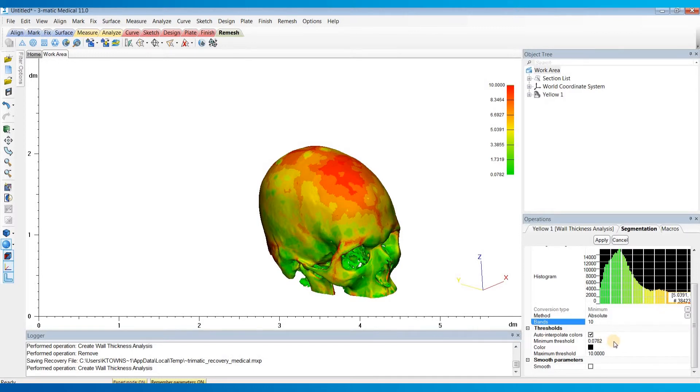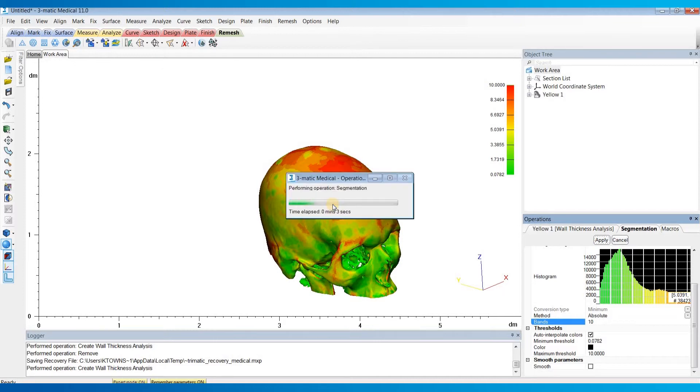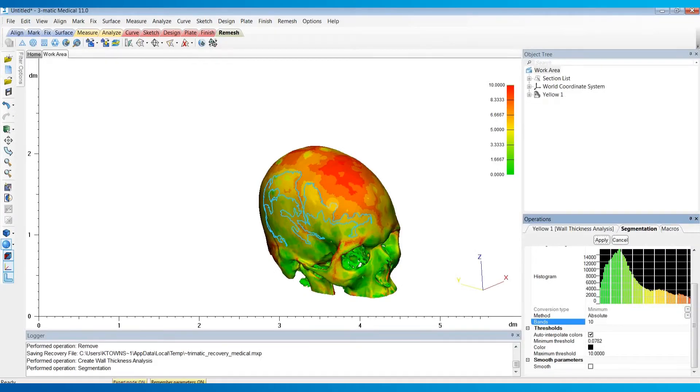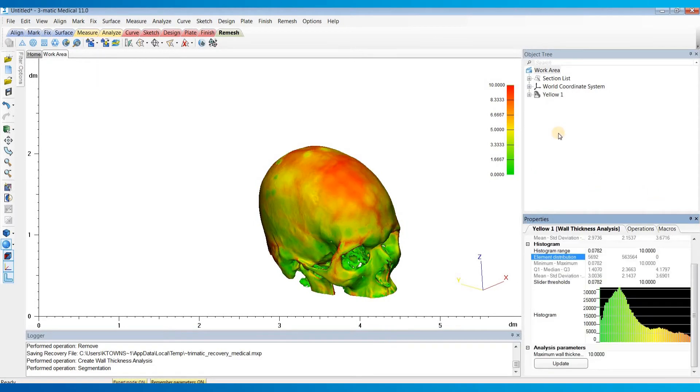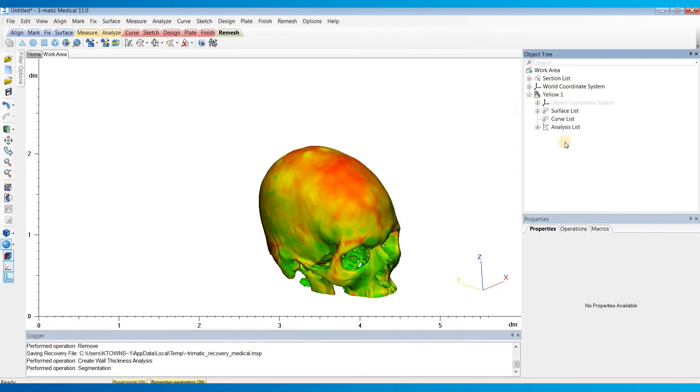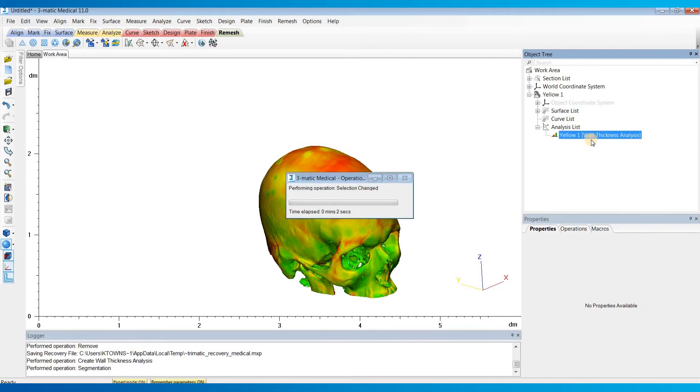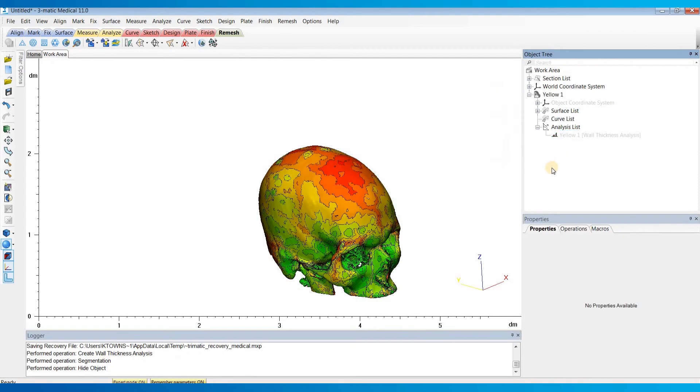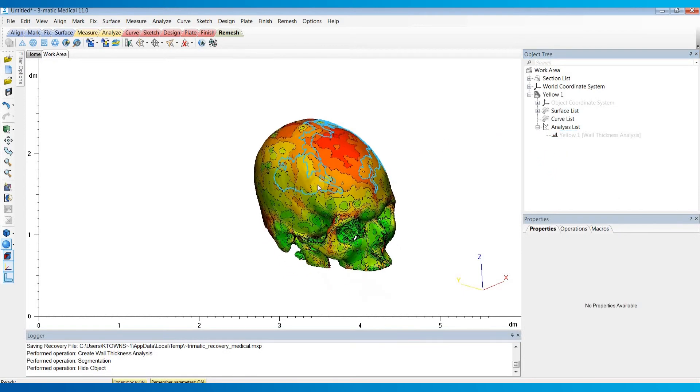So I'm going to go ahead and hit Apply. And so this tool is actually going to separate out our skull into a separate surface for each of these bands that we selected. So once that's done calculating, I'll cancel out of that. And then I'll hit this plus icon to expand our scene tree. And I'm just going to right-click and hide the analysis so we can visualize the surfaces that it split it into. Like so. So you can see there's a separate surface for each of these bands that we selected.